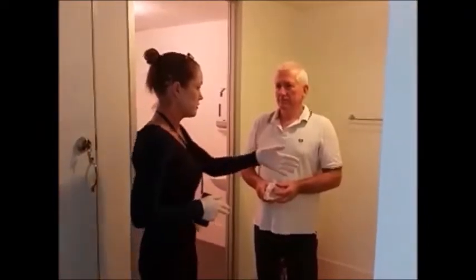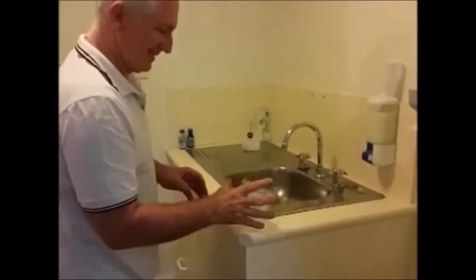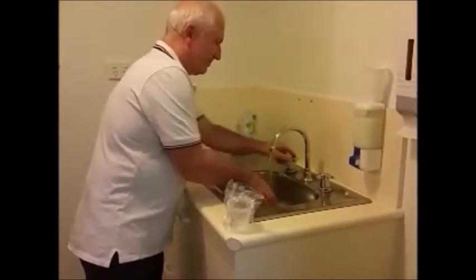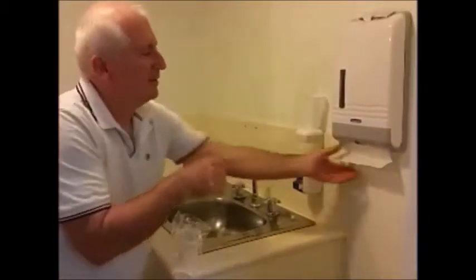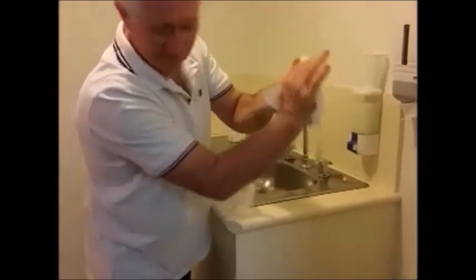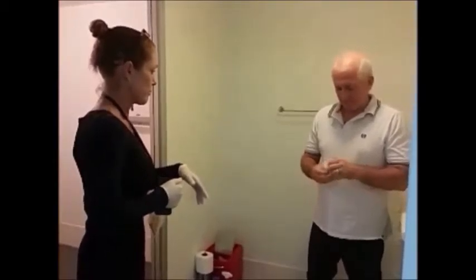Okay, Michael, I'll just get you to give your hands a rinse, please, with water and no soap. Just before you go into the bathroom. Just a quick rinse with water is fine. And you can use a paper towel up there to dry. Right, the bin's behind you. Okay, grab your cup and you can open that up now. And I'll grab the rubbish off you.